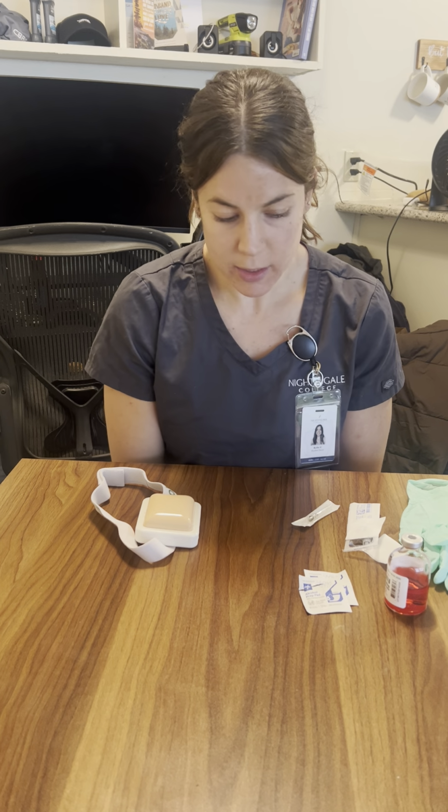I am doing remediation for the skill of intramuscular injection. So here we go. First I'm going to start off by verifying the orders and following the 6 rights of medication administration. So that's right patient, right medication, right dose, right time, right route, and right documentation. And after that, I'm going to calculate our drug dosage.